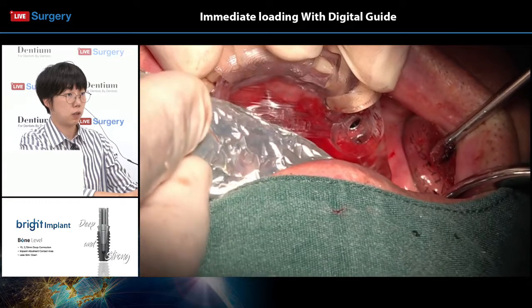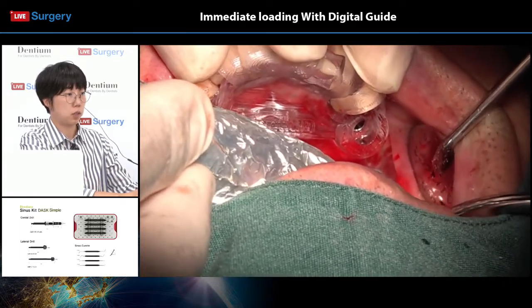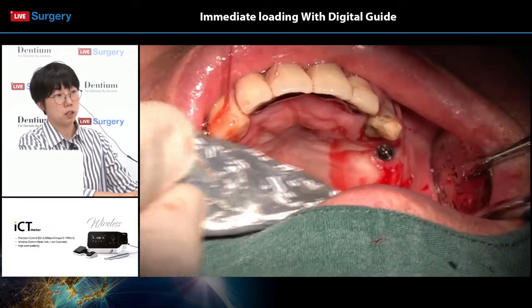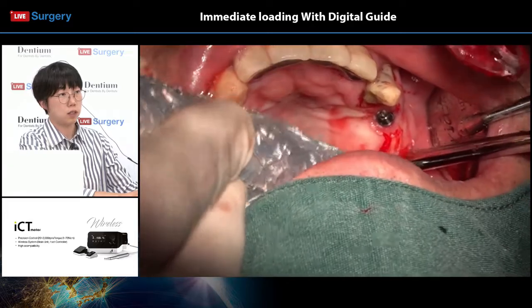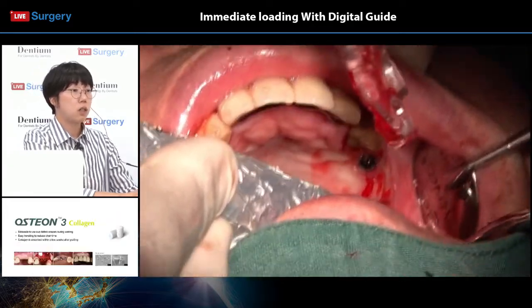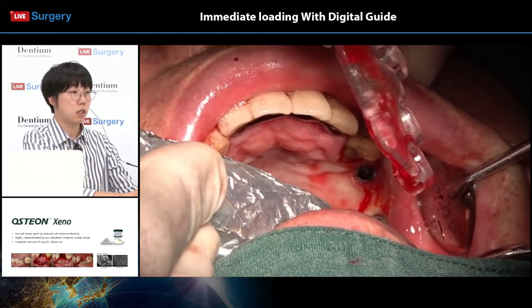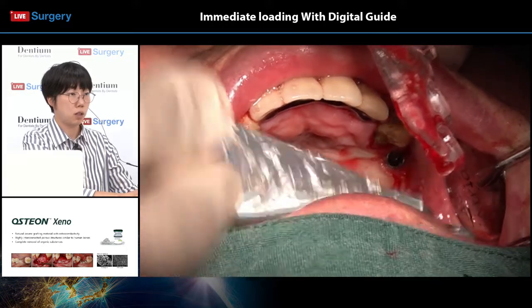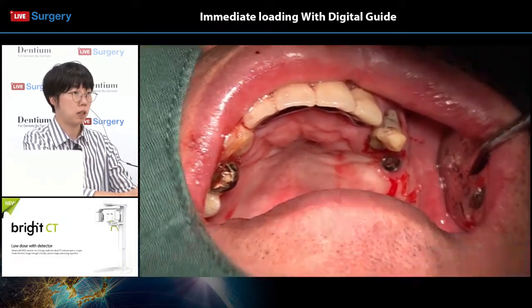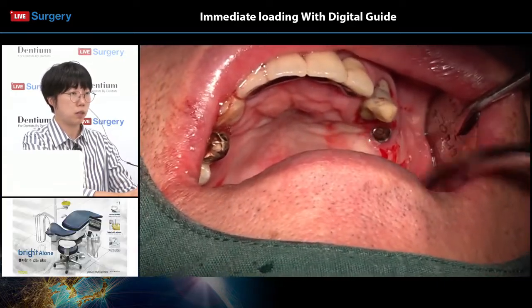After that, he is trying to position the implant on tooth number 26 area, but the fixture got stuck in the guide. So in these cases, it is important to manually position the implant into the prep site, like what you're seeing now. It can be a good way to finish your implant surgery.